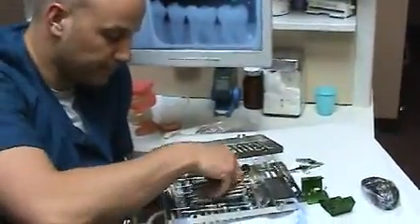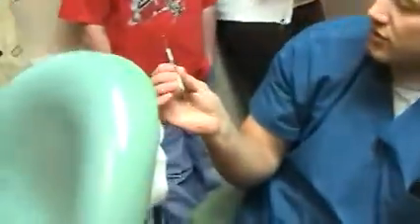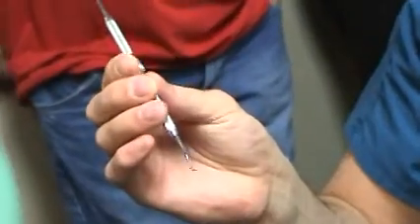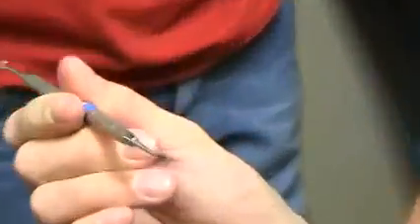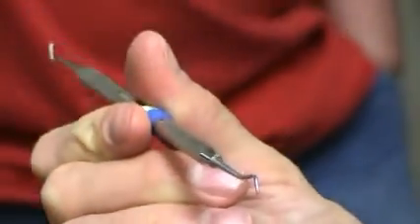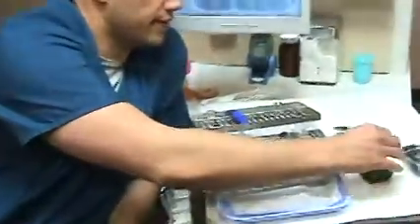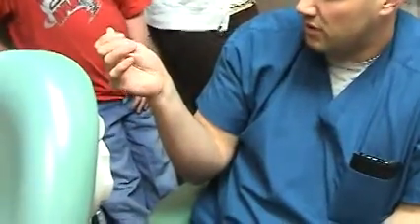Okay. This instrument looks very similar to the last one that I showed you. But this is basically simply called a spoon. Let's say I'm doing a filling, I'm doing a cavity, and I'm removing that. Usually, when I'm going to remove that, after I've drilled through the initial portion of the tooth, I'm going to use an instrument similar to this.